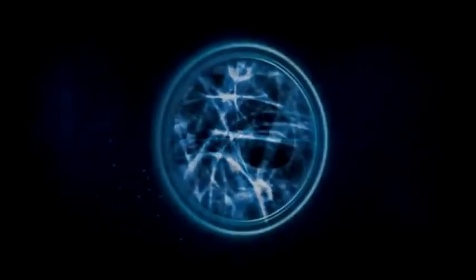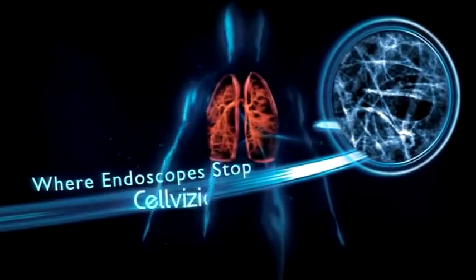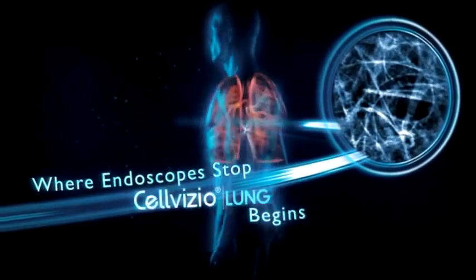Cellvizio Lung opens a new world in pulmonology with in vivo, in situ imaging of the entire bronchioalveolar tract with microscopic resolution. Cellvizio by Mauna Kea Technologies. Where endoscopes stop, Cellvizio Lung begins.